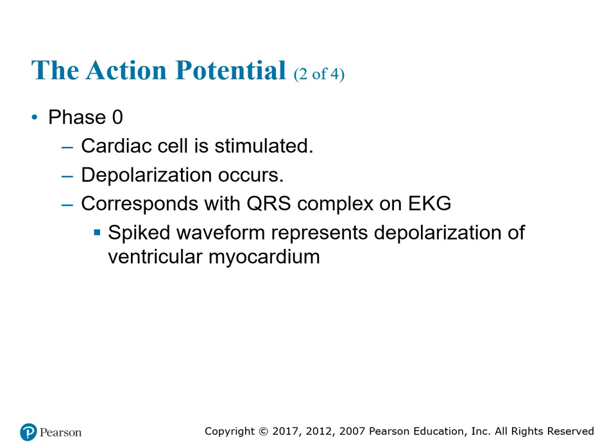In phase zero, the cardiac cell is stimulated by an electrical impulse, which triggers depolarization. This corresponds with the QRS complex on an EKG strip, which is a spike waveform that represents depolarization of the ventricular myocardium.